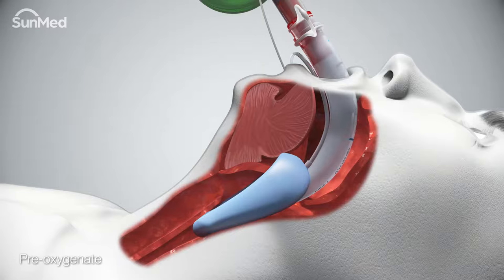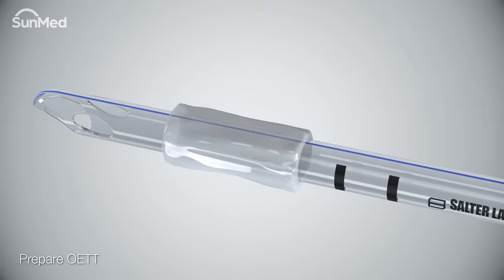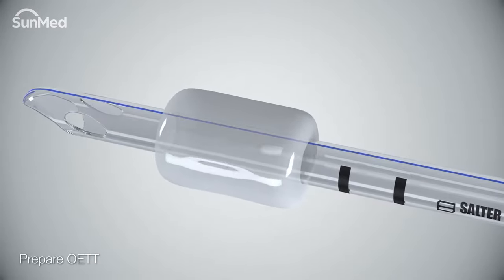Prior to intubation, the laryngeal musculature and vocal cords must be relaxed, either by an aerosolized local anesthetic or with the aid of a muscle relaxant. Then pre-oxygenate. Select the appropriate size endotracheal tube and after checking the endotracheal tube cuff integrity, completely deflate the cuff before insertion.